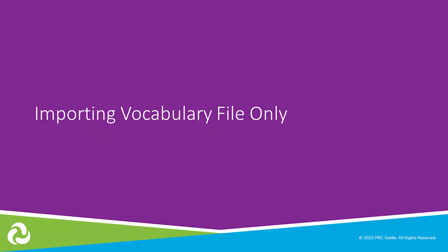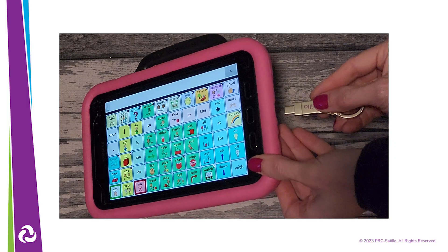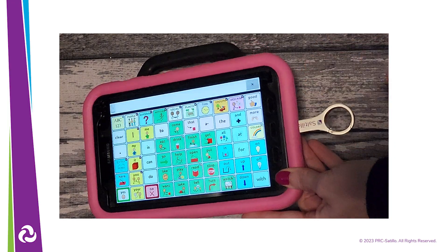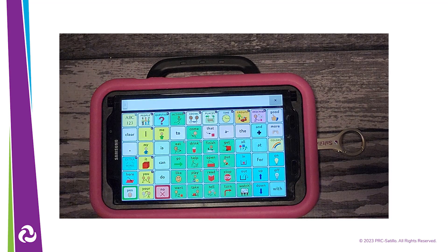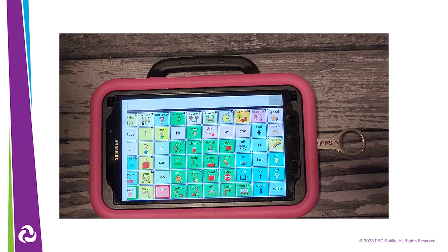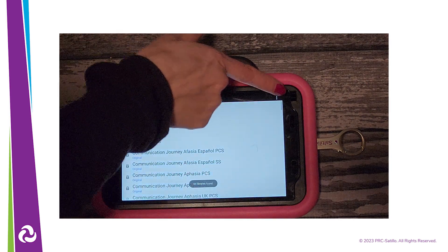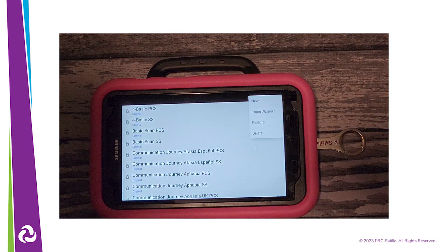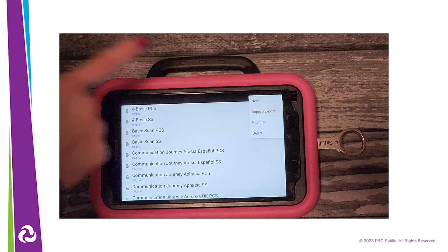To load your backed up vocabulary file back onto the NovoChat or onto a new NovoChat, you will want to import the file from the dual USB drive. Insert the dual USB into the charge port on your NovoChat device. Select the menu, then select Library. Select the three gray dots in the upper right corner, then select Import-Export.